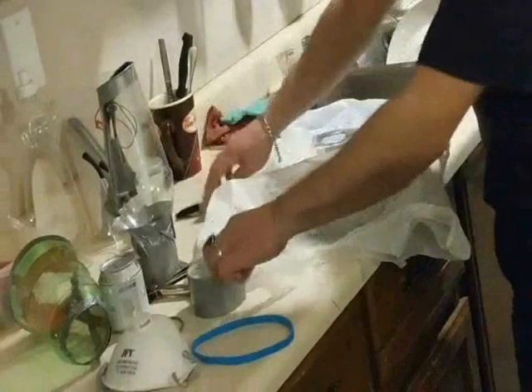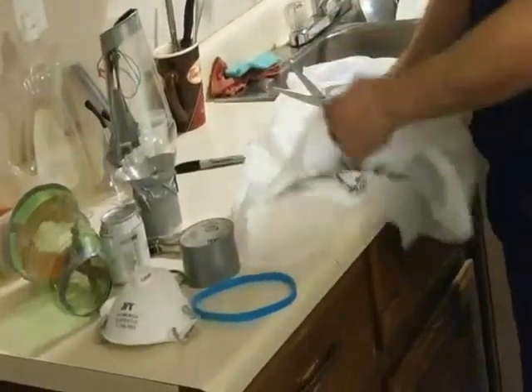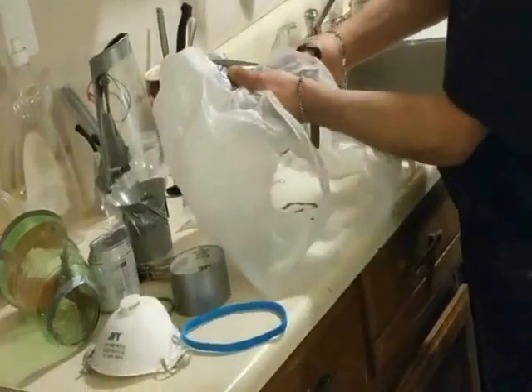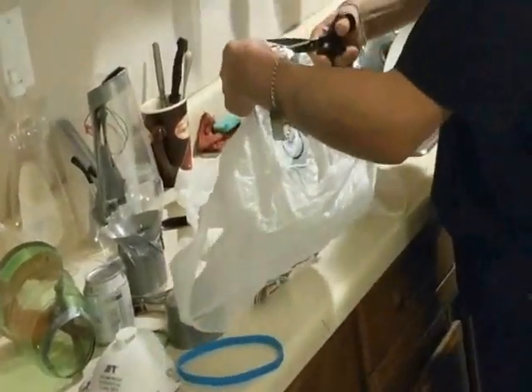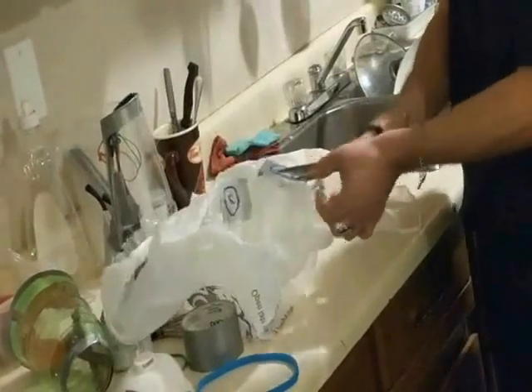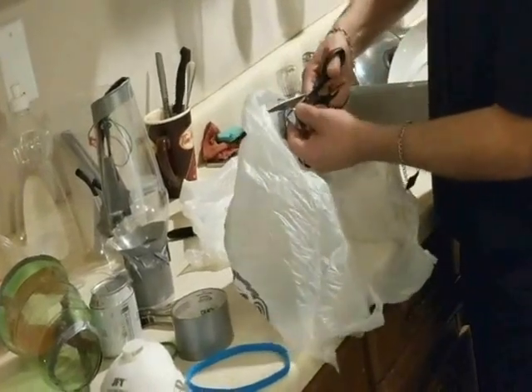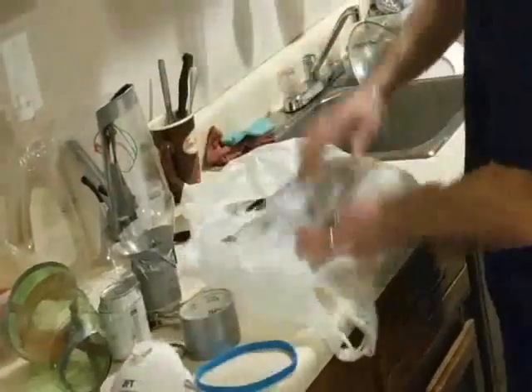Then you can cut away with your scissors. I'm going to demonstrate just one for you, and you can see that's what we want to come up with. So I'm going to poke it in the middle, and then cut along where you drew with the black marker. You should now have one eye that you're able to see through. And there you go, that's pretty much one eye done.